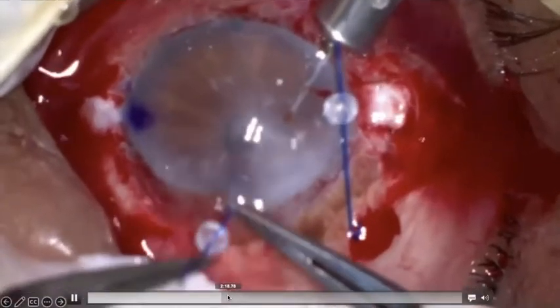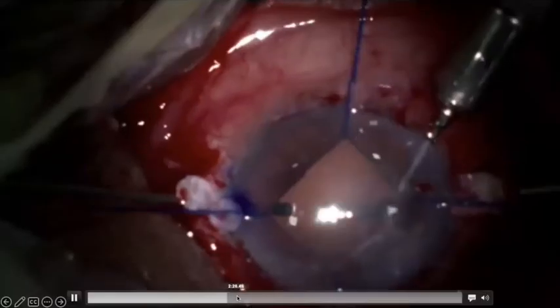Now what I'm doing is I've put in iris hooks to enlarge the pupil a bit and do a vitrectomy. We see the intraocular lens has actually fallen down. So that's the reason it's also important to check what is happening in the posterior chamber and not just assume.